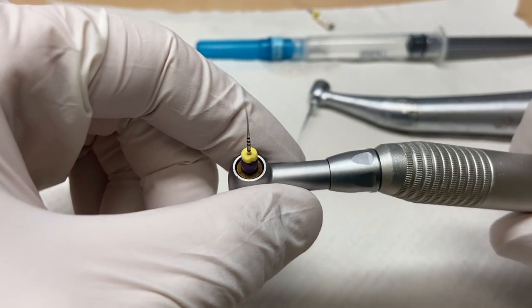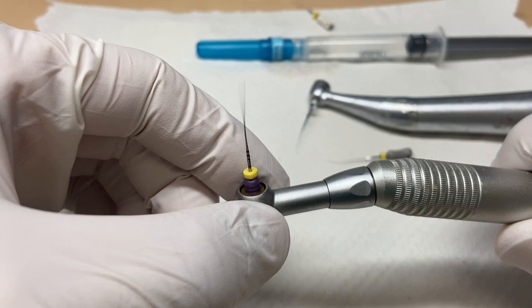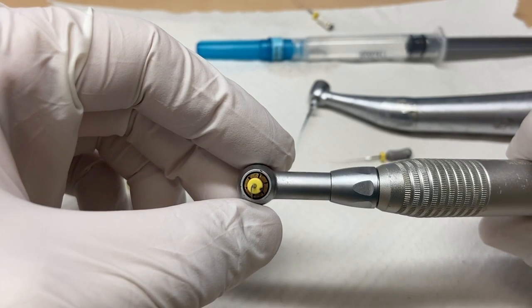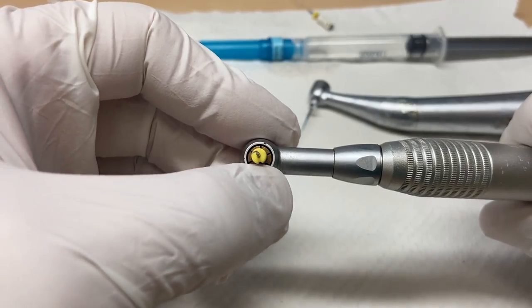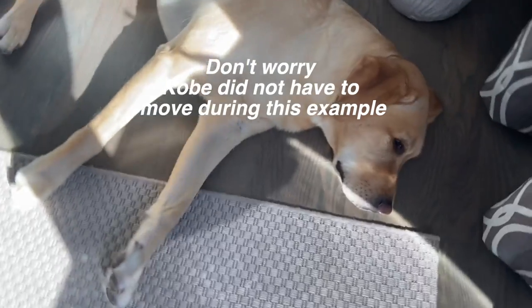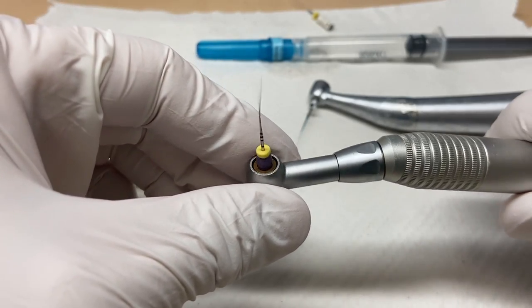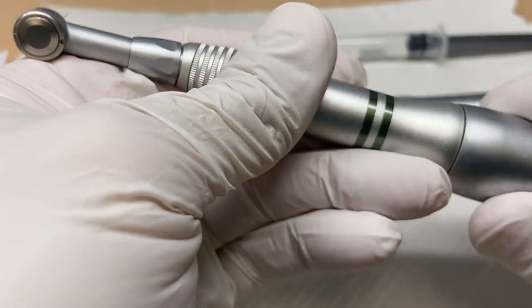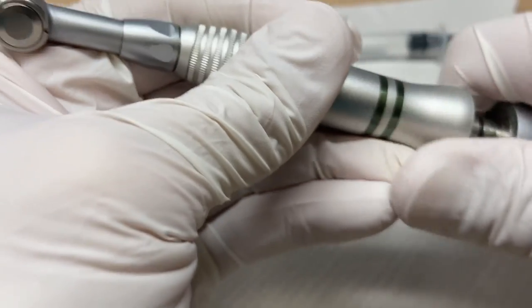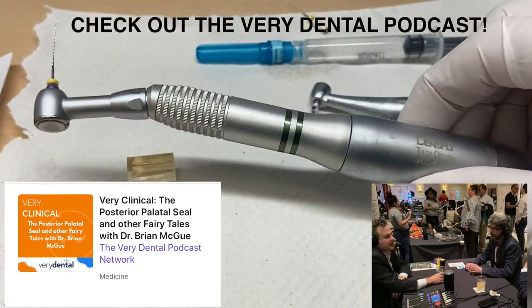What essentially it does is you take your hand file, you place it down to length. And then this, in those really tight canals, it'll just do the watch winding for you. So what it's doing is it's going 30 degrees one way, 30 degrees the other way. Counterclockwise, clockwise. And what you can do is easily fabricate your GlidePath. Now I've just got the handpiece right here. That's all it is.